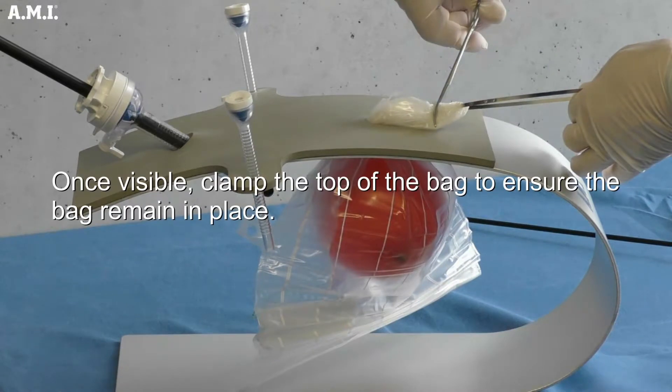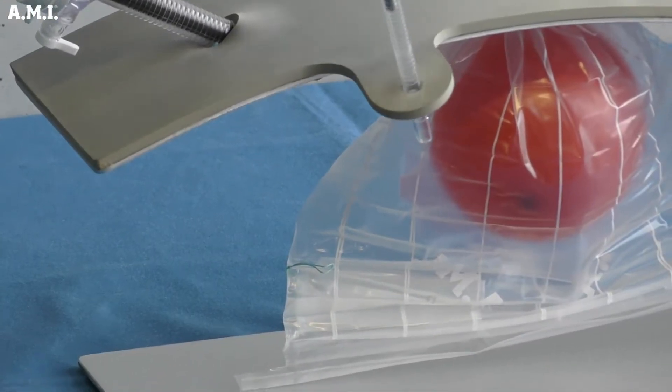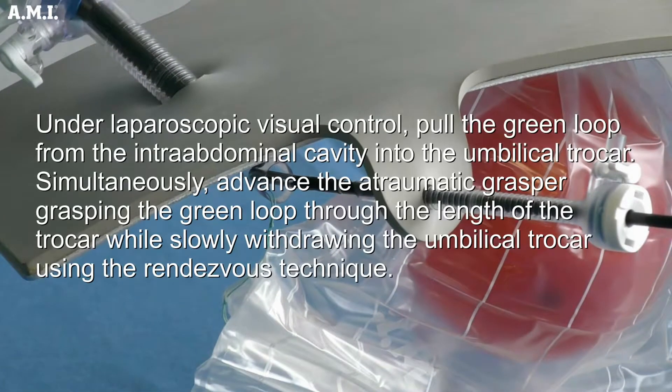Once visible, clamp the top of the bag to ensure it remains in place. Grasp the green loop at the end of the small opening of the morsel bag using the Atraumatic grasping forceps. Under laparoscopic visual control, pull the green loop from the intra-abdominal cavity into the umbilical trocar. Simultaneously advance the Atraumatic grasper — grasping the green loop — through the length of the trocar while slowly withdrawing the umbilical trocar using the rendezvous technique.